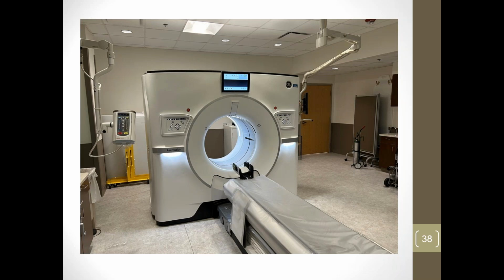Another thing that they do is cardiac stress testing, where they test a patient for any cardiac issues, or if they need to send them to the cath lab, they use nuclear isotopes in a gamma camera. And then they make them run on a treadmill, and then they re-examine them and see where the isotopes end up and if there's any blockages within the heart. And then they can say, yeah, we need to send you to the cath lab. Well, this kind of eliminates that for people that may not be able to tolerate the stress test. So it's kind of a nice, quick way to help people without making it too excessive.